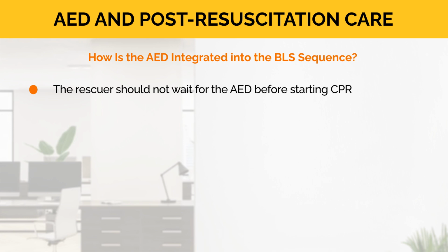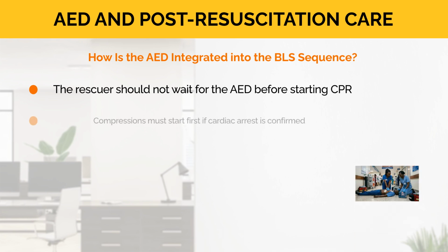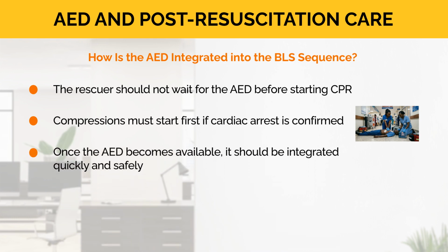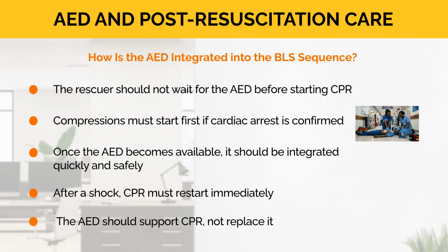The rescuer should not wait for the AED before starting CPR. Compressions must start first if cardiac arrest is confirmed. Once the AED becomes available, it should be integrated quickly and safely. After a shock, CPR must restart immediately. The AED should support CPR, not replace it.